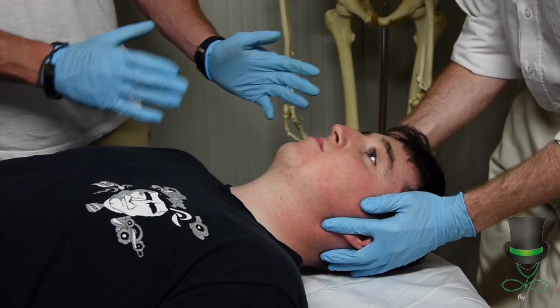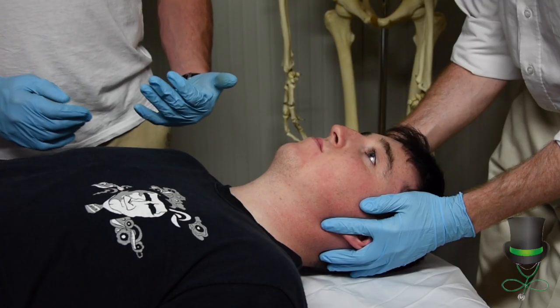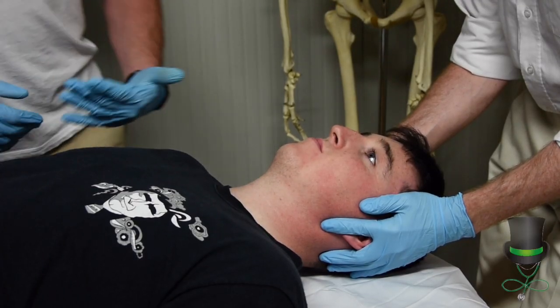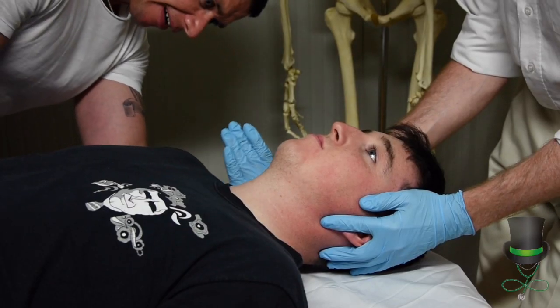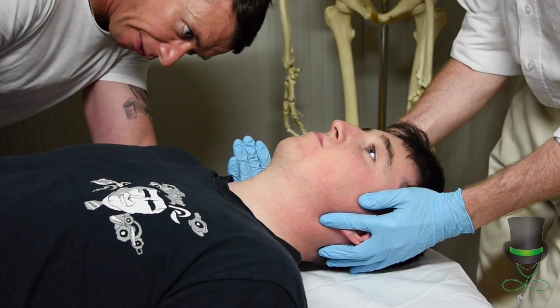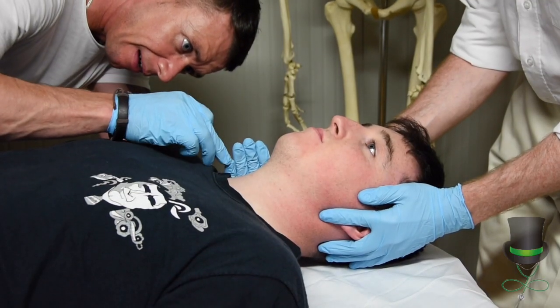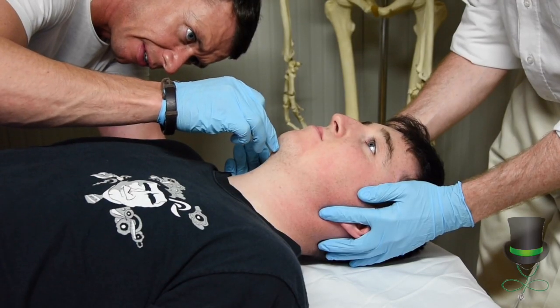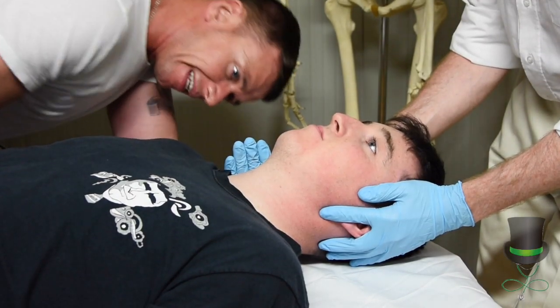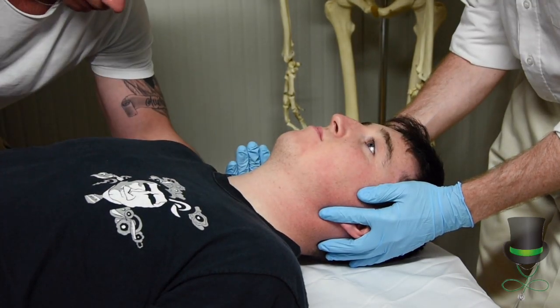When c-spine is in place, the first pre-hospital provider will then measure for a collar. How we measure for a collar is we use our hand — the back of our hand — and place our hand onto the shoulder of the patient. We count how many fingers to the base of the chin. In this case there are four fingers, ensuring that the fingers are pointing straight out.